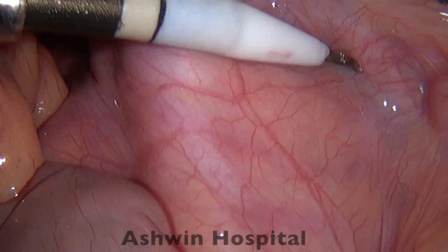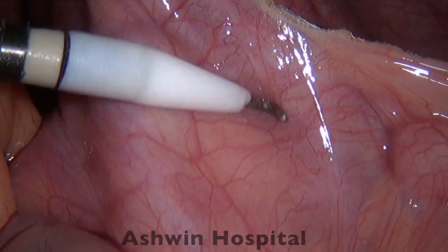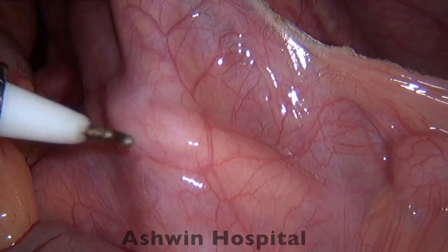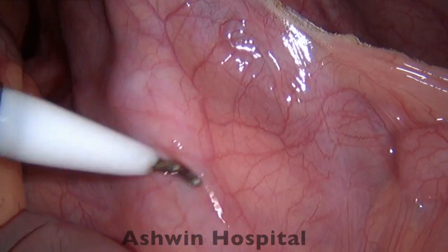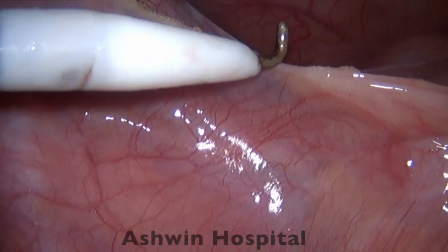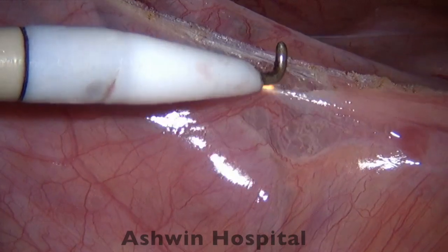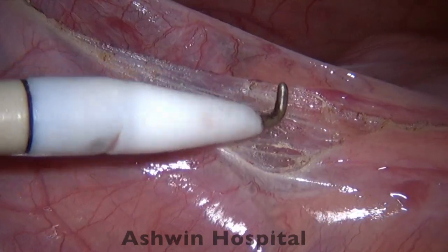When doing the mobilization we have to be wary of the right ureter. Here you can see the ureter which is clearly present, and the peristalsis will also be appreciated shortly. We know for sure the ureter is present at this level and should always keep it in mind — even with the magnification of laparoscopy it is only a couple of centimeters away from the area of dissection. The other key is traction.